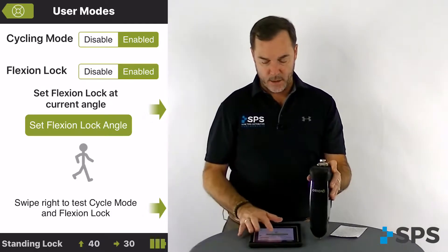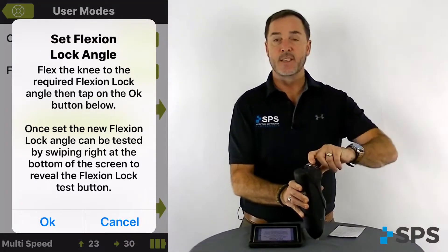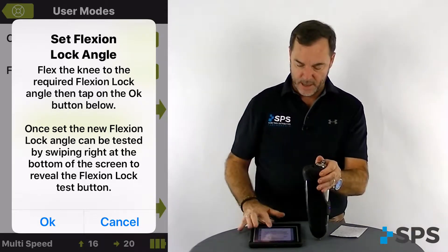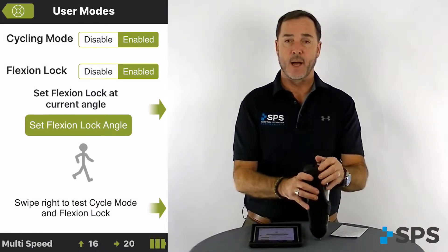To set the flexion angle lock, select set flexion angle lock. It's going to ask you to flex the knee to the desired angle that the patient would like flexion lock. So if it's for maybe golfing, we would set it there, press ok, and that sets our flexion angle lock.